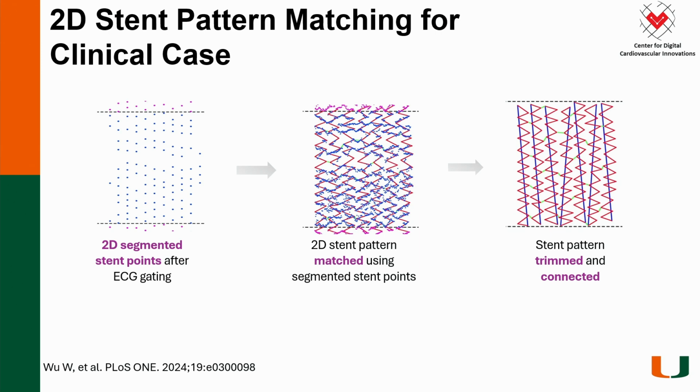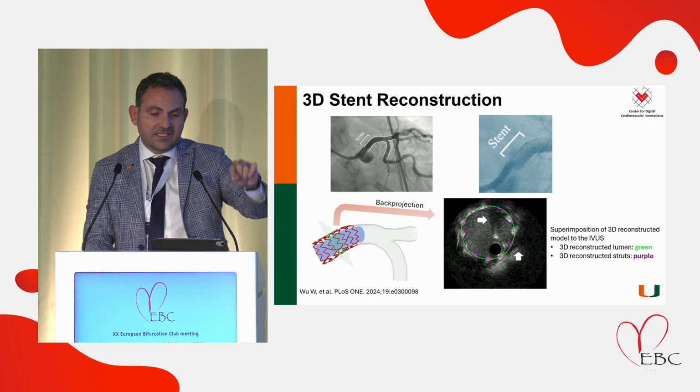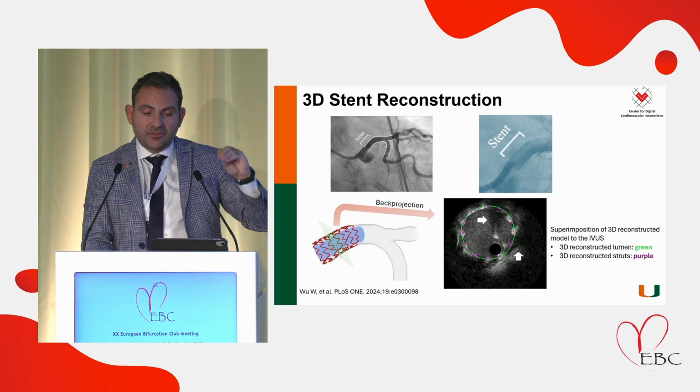Then in the middle, we now match the stent design of this Megatron to the actual patient stent here. And then finally, we end up rolling back the whole stent into the 3D lumen. And you see here, that's the 3D Megatron stent from the body into the computer.